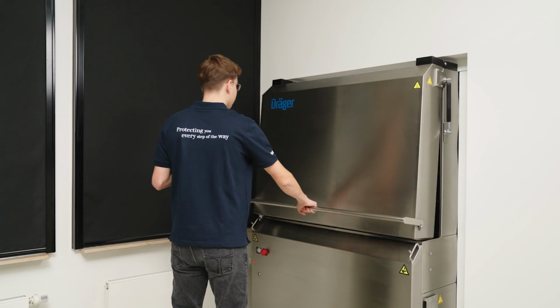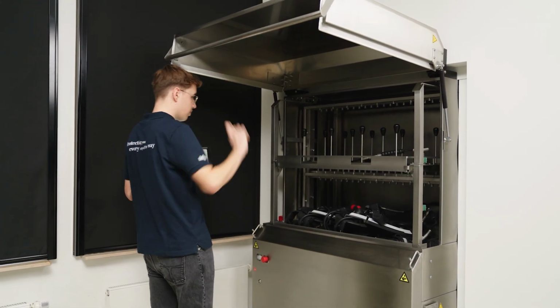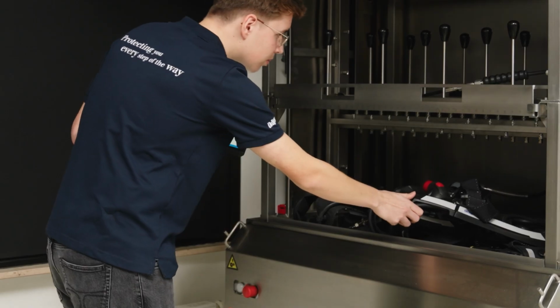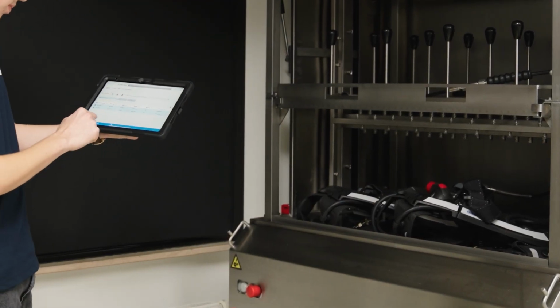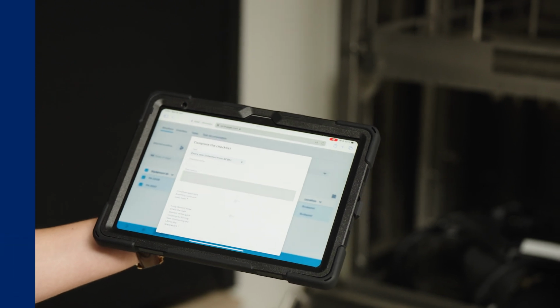Equipment cleaning can be documented using a checklist. For example, the wash program, temperature and dosage can be documented. If the washing process is interrupted, error messages and the reasons for the interruption can also be recorded.